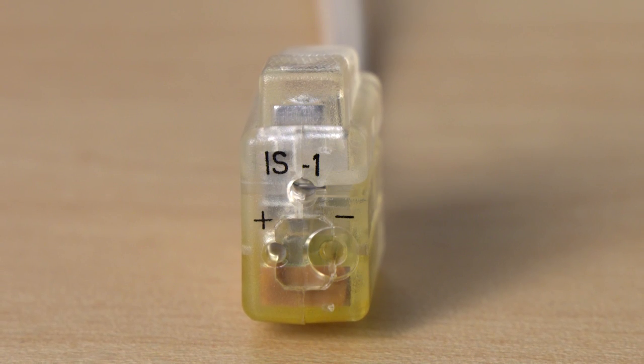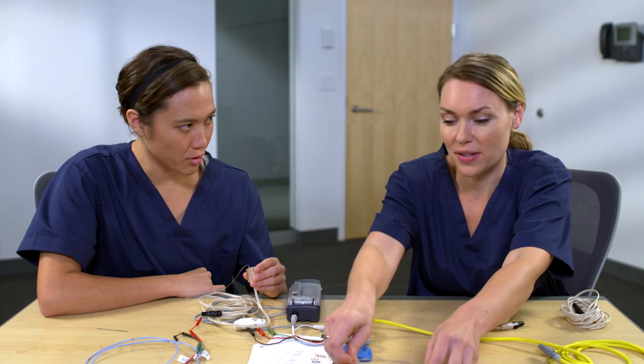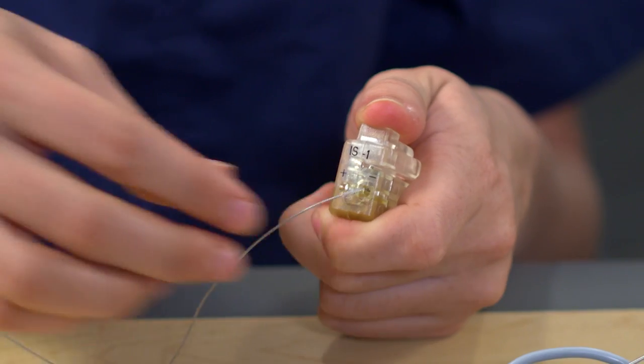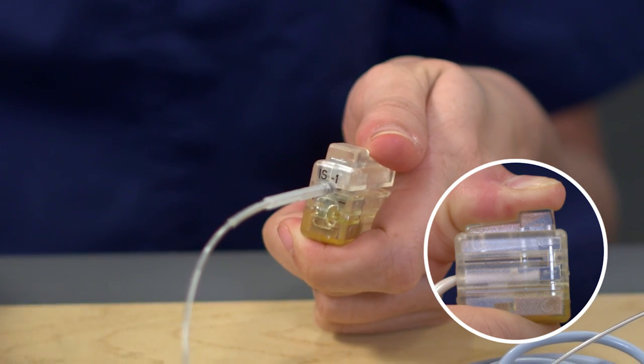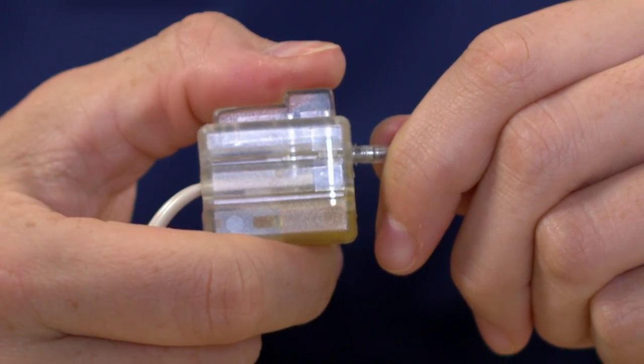There is also a port labeled IS-1 on this cable. Permanent pacing leads manufactured today are IS-1 leads, and the 5487 cable does accept an IS-1 lead. Let's practice placing an IS-1 lead. The port labeled IS-1 will accept an IS-1 lead — this top port is used for connecting with an IS-1 lead. To place an IS-1 lead, depress the button and insert the lead into the IS-1 port. To verify it's secure, check through the side window that the lead pin extends beyond the connector blade. Now you have practiced both applications with the 5487 cable and with the 5433.